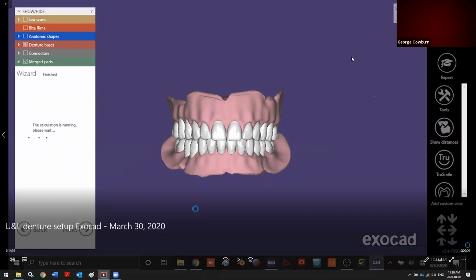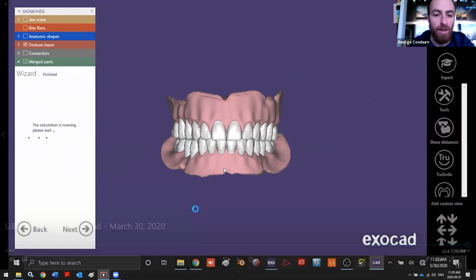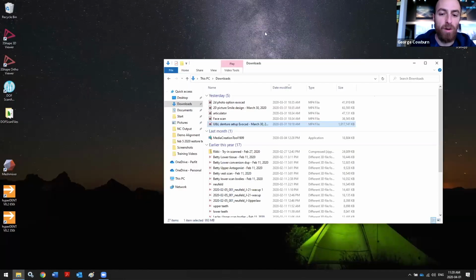Oh, looks like my video is going a little bit funny. So that's the main issue, is that when we're adjusting the occlusion, actually, I have a great video here that I can show you that on. That's where we need to change the morphology of the tooth. And that is not easy to do if you start with a pre-manufactured tooth. So this is where they have jigs and different ways of holding it so that you can make the appropriate adjustments. The best thing about 3D printing is that it makes all that challenge go completely away.